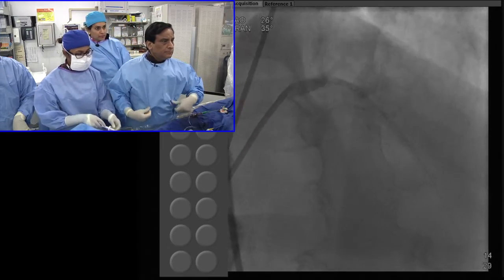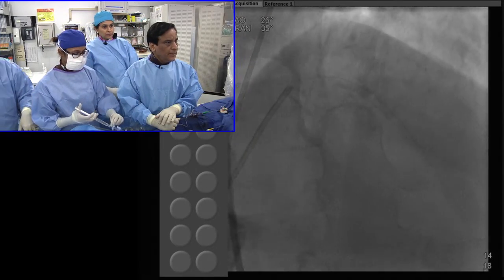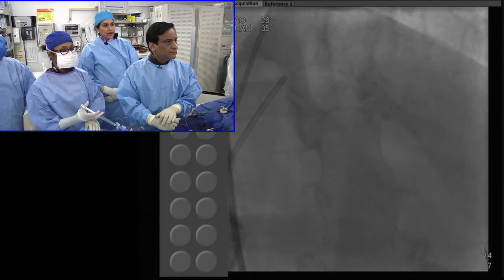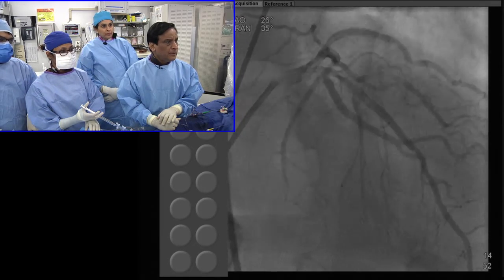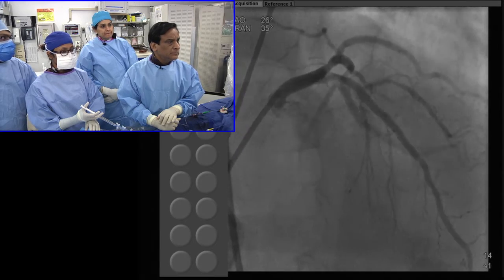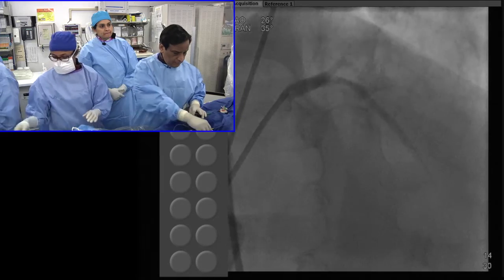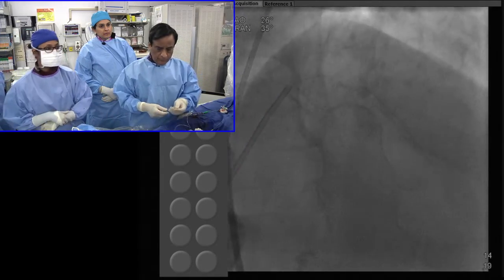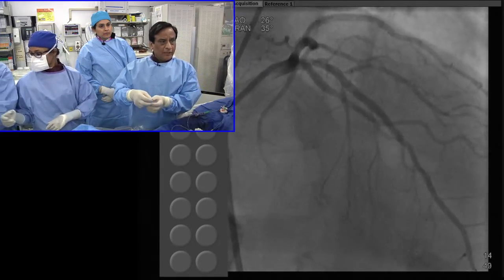We have got some issue distally and the side branch is looking a little pinched. But that is the usual look of the side branch — flow is good. We'll put a 3.5 by 12 proximally. Need to do a balloon distally? We can just massage with low pressure — this is not a long lesion, vertical displacement of the plaque — low pressure, 2 atmospheres from this 3.5.